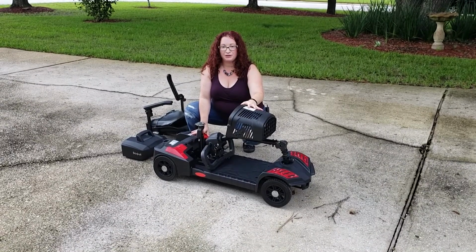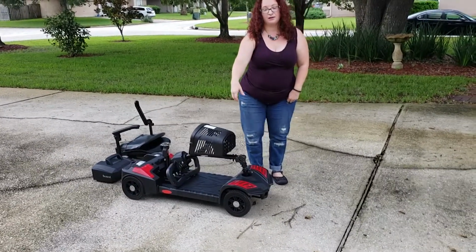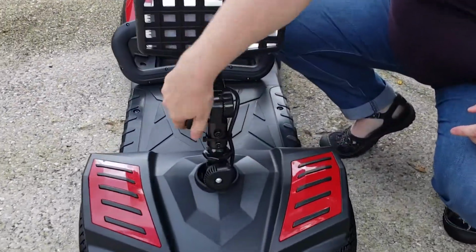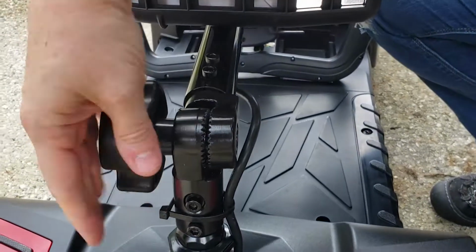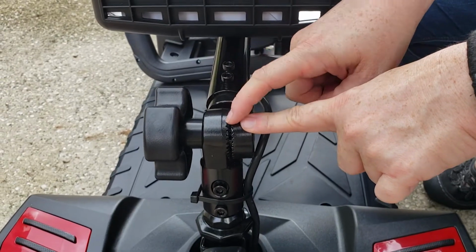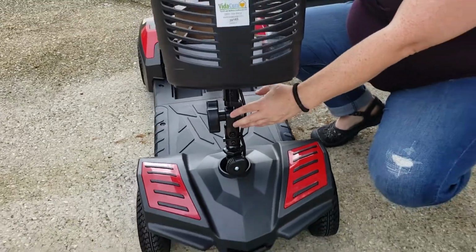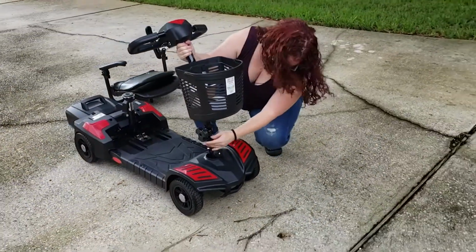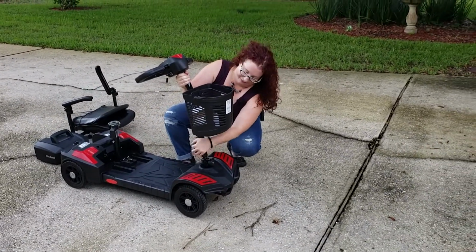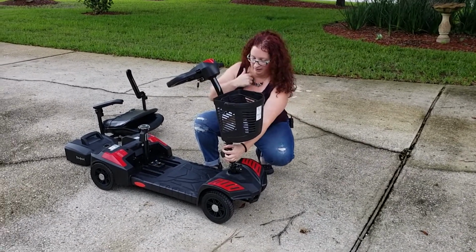Okay, so those pieces are together. I'll next lift up this tiller part. An important part about this is to make sure that the teeth on the bottom of the tiller, when you unscrew it, are far enough apart. Because if they're too close and you lift this tiller, over time, these teeth will wear down and then your tiller won't stay up anymore. So you need to just make sure they have enough space. And then just tighten it back up again.